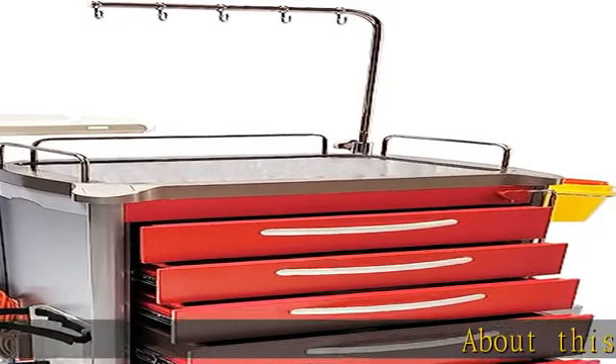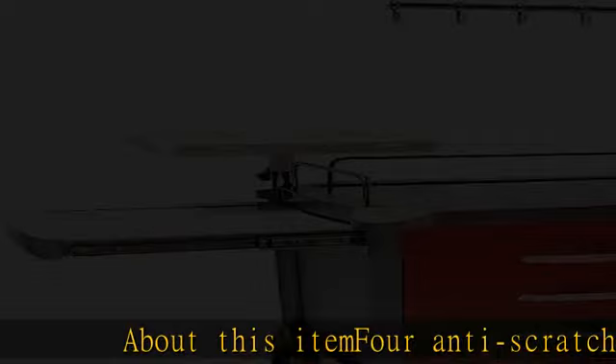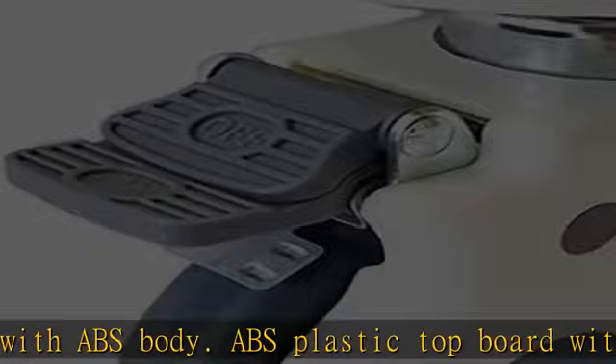About this item: anti-scratch aluminum alloy columns with ABS body, ABS plastic top board, with stainless steel side rails around for protection, IV transfusion hook at the top, disposable sharp container, sliding writing shelf, utility container cart.